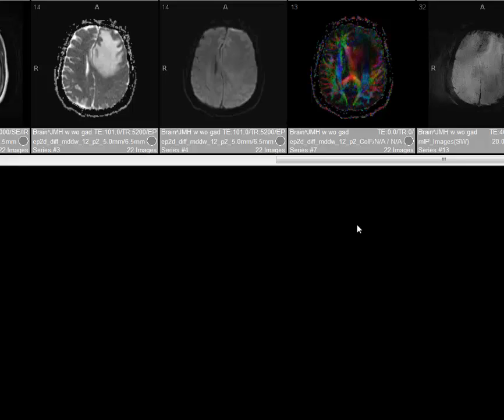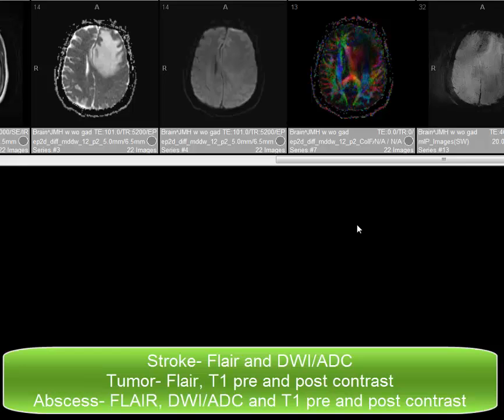In conclusion, we perform all of these sequences in MR imaging of the brain, though particular sequences are more important in particular cases. In stroke patients, FLAIR and diffusion-weighted imaging are most important, as DWI can detect an infarct as early as 30 minutes into an infarction. For tumor or infection cases, FLAIR and T1-weighted images without and with contrast are used to evaluate enhancement. If bacterial abscess is suspected, diffusion-weighted imaging is also important because bacterial abscesses restrict in the center.